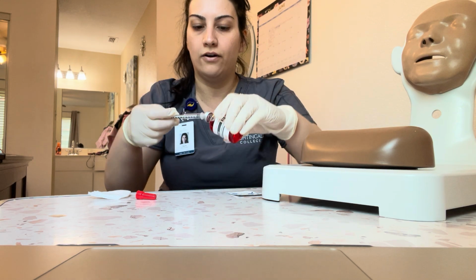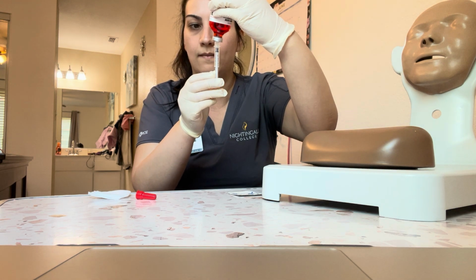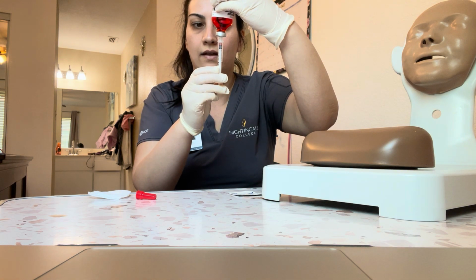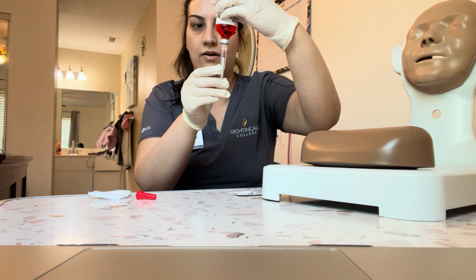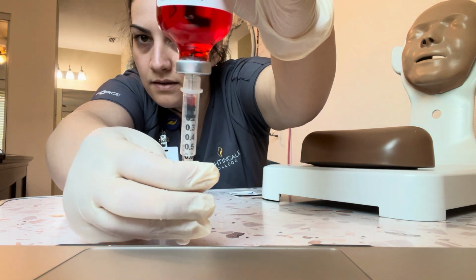And we're going to invert, and we're going to draw up the 0.1 milliliters of the solution. We're going to tap if there are any bubbles, and if there are too many bubbles, we would just inject that back and withdraw again. Bubbles, no bubbles. So 0.1 milliliters.